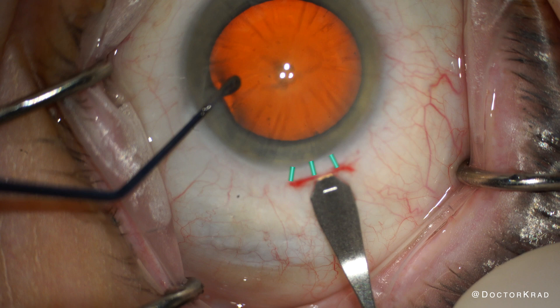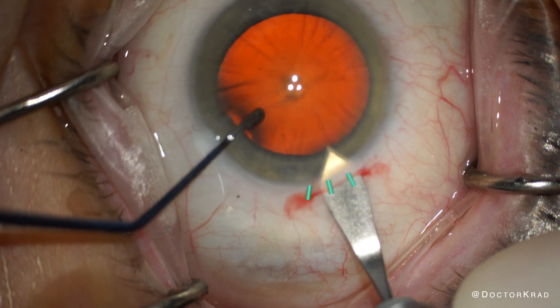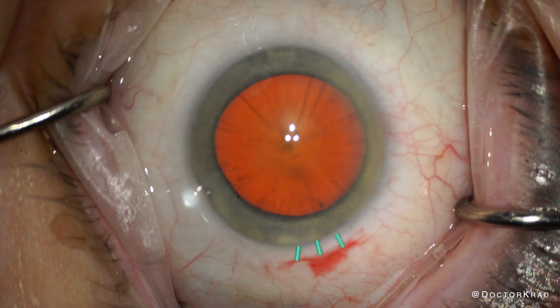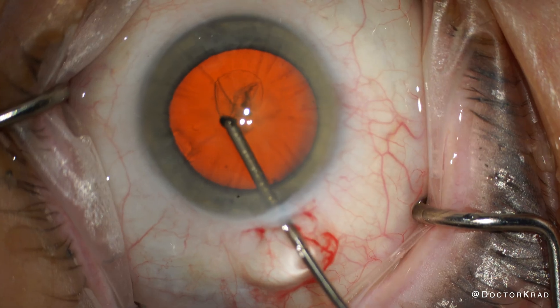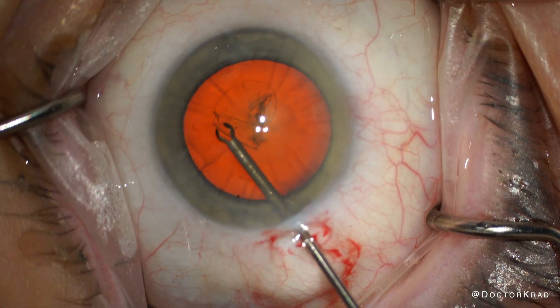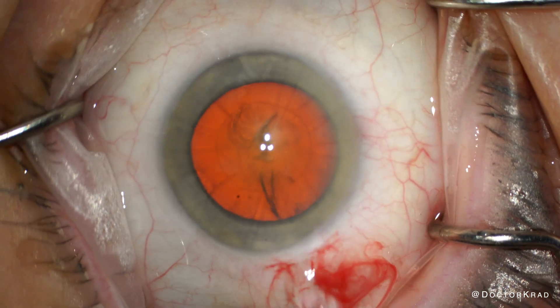The scleral lip from the scleral tunnel should protect the RK cut from becoming radialized from the main incision. This will only be effective if your incision through the sclera is deep enough. If you're too superficial, that scleral lip will not have strength, and then you can just radialize into that RK incision.